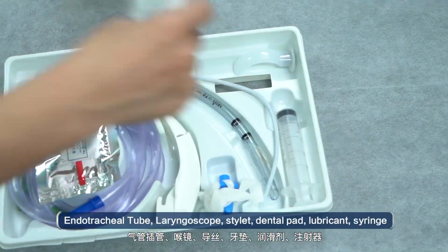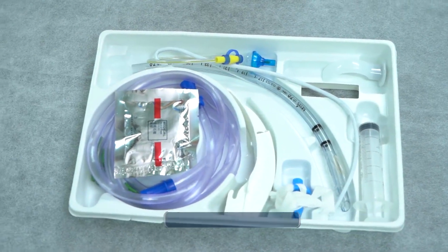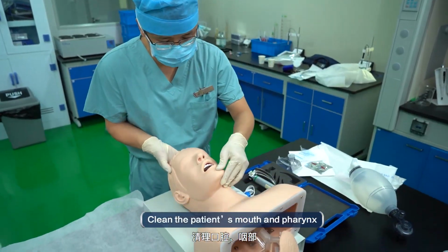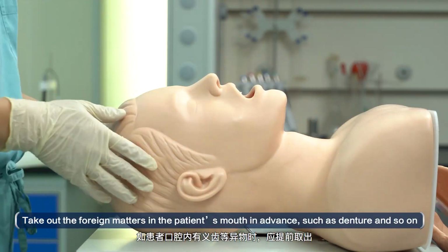Endotracheal tube, laryngoscope, stylet, dental pad, lubricant, syringe. Clean the patient's mouth and pharynx. Take out the foreign matters in the patient's mouth in advance, such as dentures and so on.